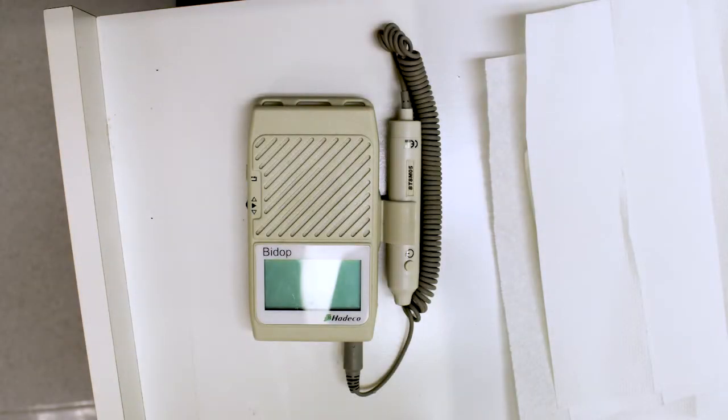A Doppler ultrasound is a device which uses sound waves amplified through a microphone to bounce off blood cells. This allows you to listen to the quality of blood flow of the artery. These are the parts of a Doppler that you will need to know.